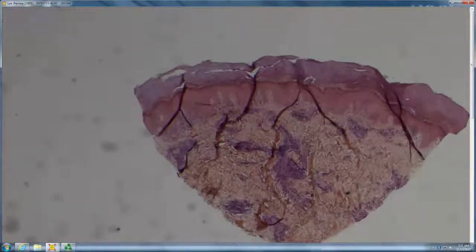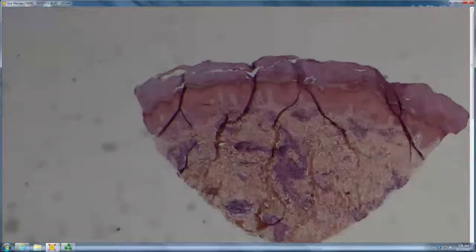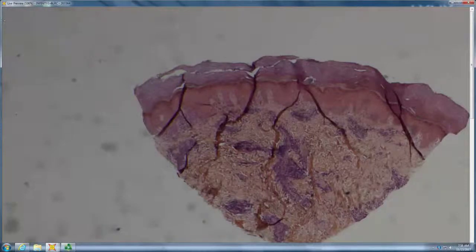Yeah, so are you thinking segmental hyalinizing vasculopathy? So this is exactly segmental hyalinizing vasculopathy. What's the clinical name for what that produces? Livedoid vasculopathy, or atrophie blanche. All the same thing. So atrophie blanche, which is where you get the little white atrophic scars, usually very painful because of the ischemia. Livedoid vasculopathy, because it's a livedo pattern and you've got vasculopathy, not real vasculitis, or segmental hyalinizing vasculopathy, which is just describing the pathology. Okay, so that's your patient. Now what do you work them up for?